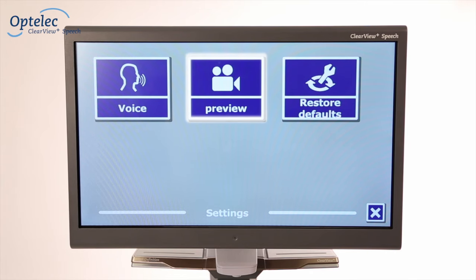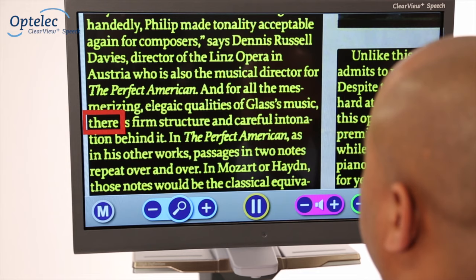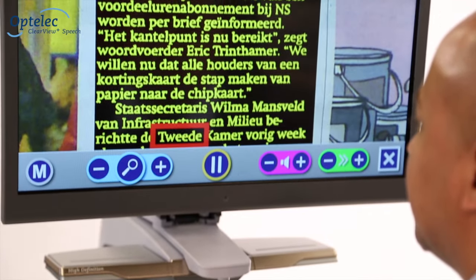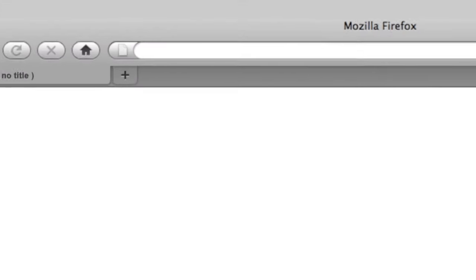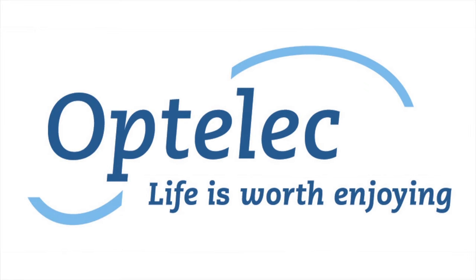You can also turn off the preview function or restore factory settings. The Clearview Plus Speech makes reading a pleasure. Visit our website at www.optelec.co.uk. Optelec — life is worth enjoying.